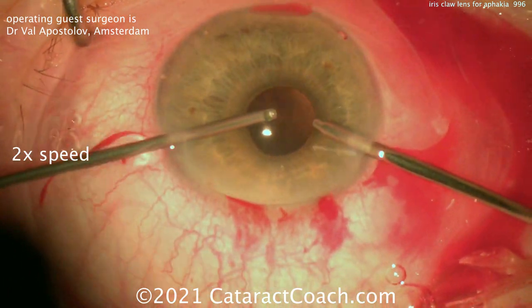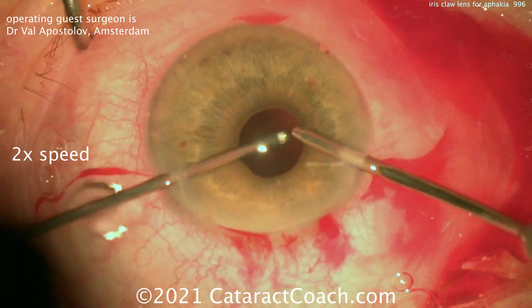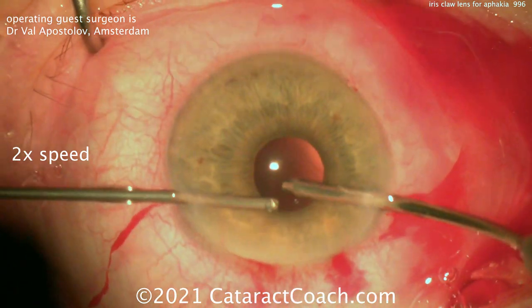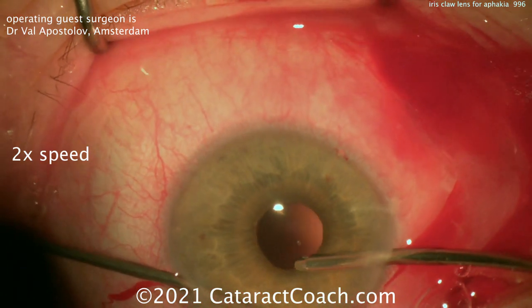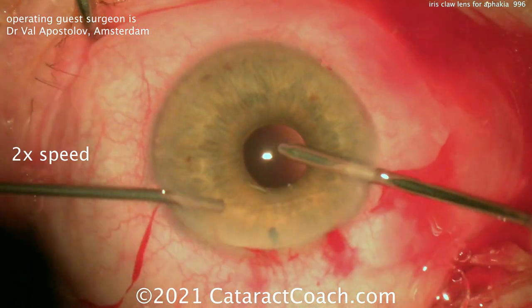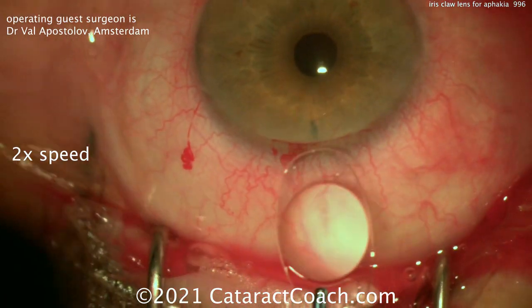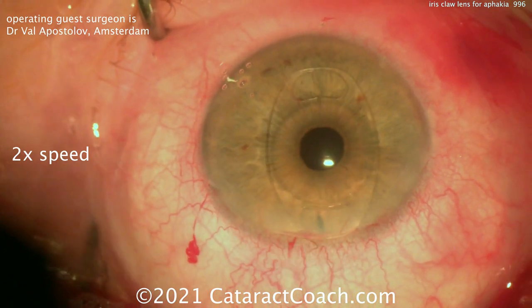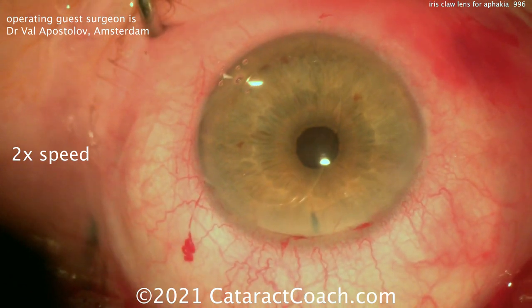That's a very nice cleanup. Now you can put an anterior chamber lens in. You can do a scleral-fixated lens such as a Yamane technique, or using Gore-Tex to suture a lens that has eyelets — all those are very appropriate. I would not recommend suturing a lens to the back of the iris in a case like this, because there's no capsular back support and those two sutures aren't going to be enough.